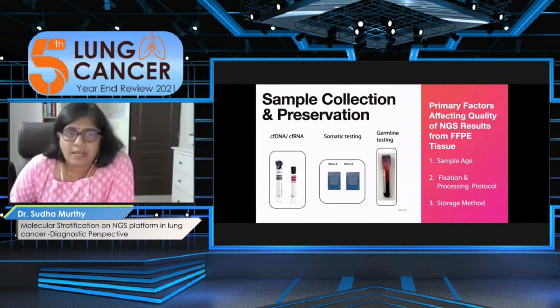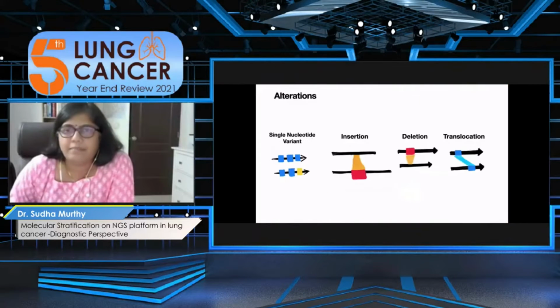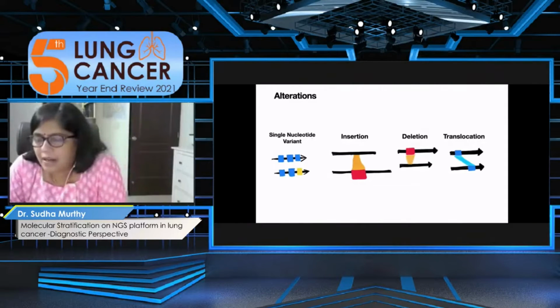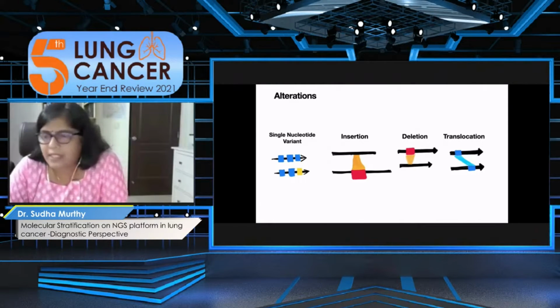Sample collection and preservation. We know for somatic testing, generally it is the tissue. We can of course do it on liquid biopsies as well, and for germline testing we use EDTA blood. Now just to highlight the basic terminology, it might sound very preliminary, but it is for the benefit of novices or postgraduates here.